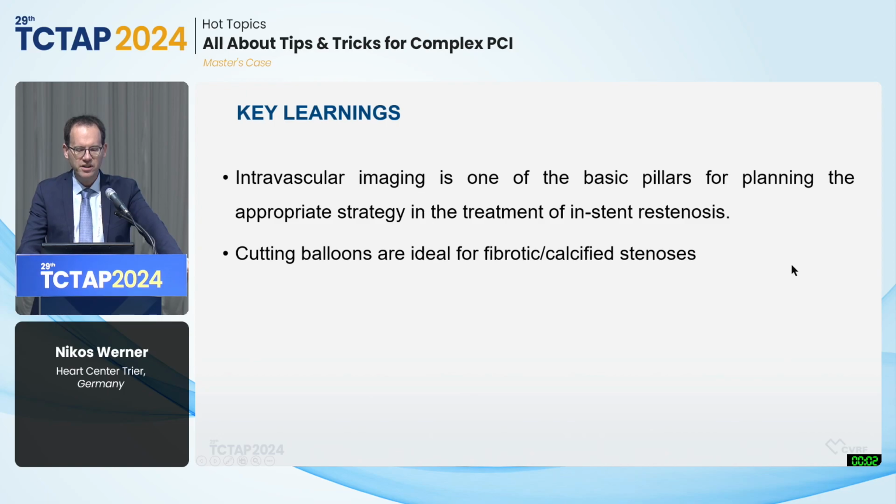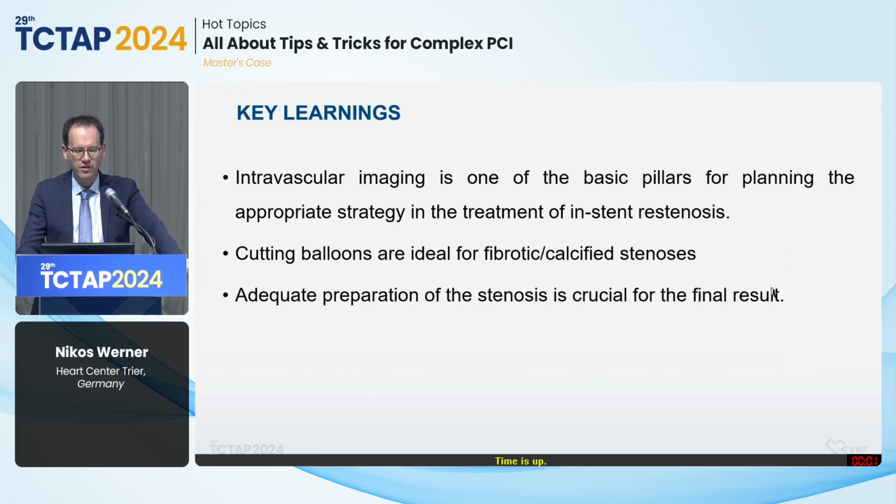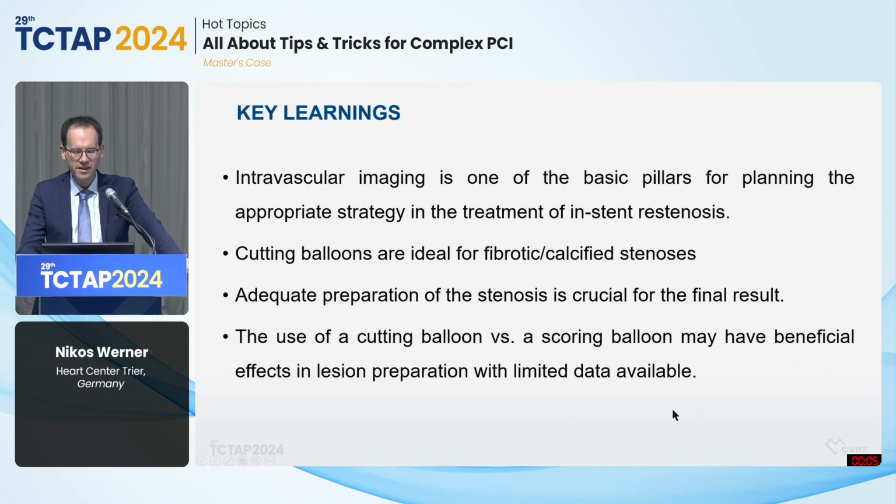The cutting balloons are ideal for fibrotic and fibrotic calcified stenosis. Adequate lesion preparation is crucial for the final result, and the use of cutting versus scoring balloon may have some beneficial effect in lesion preparation, but we have very, very limited data available in terms of the perfect procedure. Thank you very much.